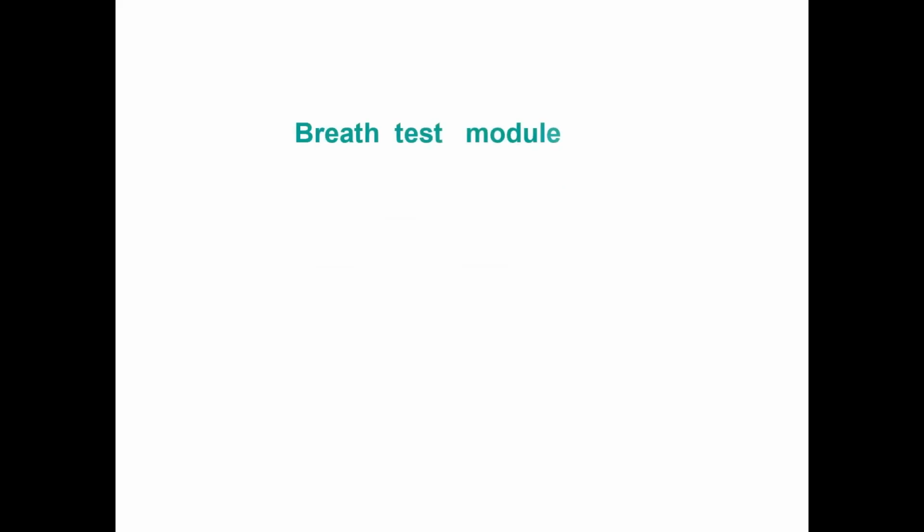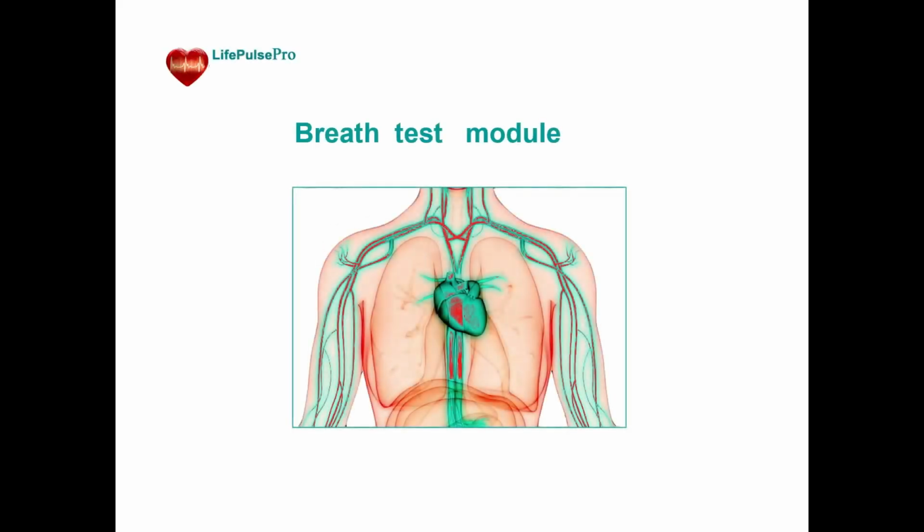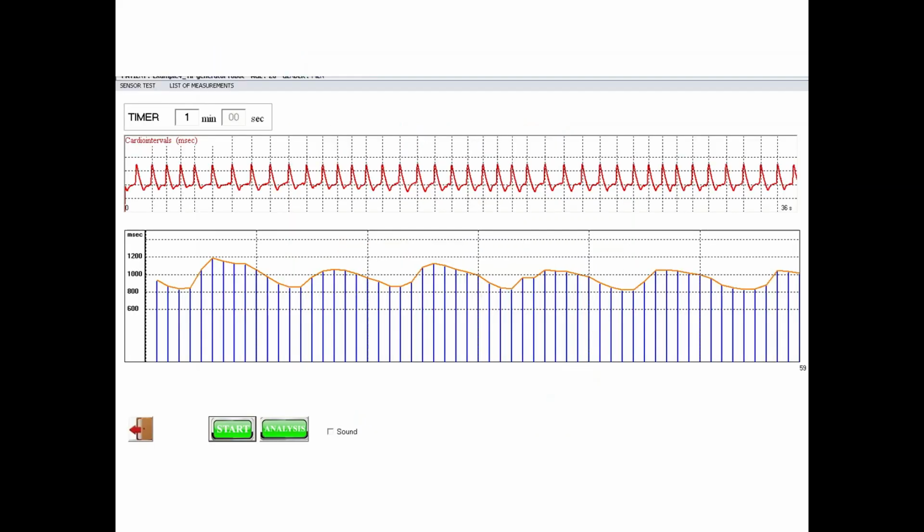The breath test module evaluates the response of the cardiovascular system to controlled deep breathing. The results of recording pulse waves are shown here. We see a wave-like graph of changes in cardio intervals under the influence of 6 deep breaths.